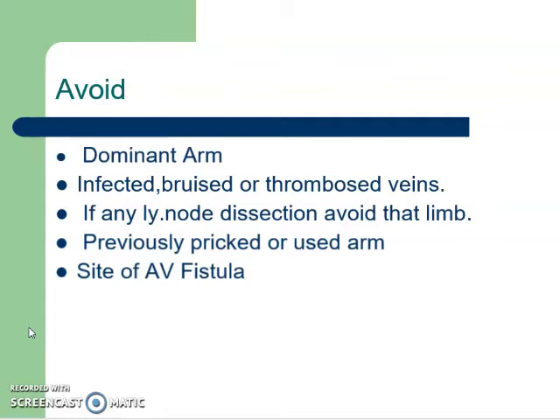You should not select a vein, the skin over which is infected or bruised. And if you feel the vein and it is thrombosed, don't select that vein, because you might fail in cannulating. Do not select a vein which is already pricked, because if one has failed to cannulate a vein, then you also may fail to cannulate the same vein. And besides that, the vein may be thrombosed.